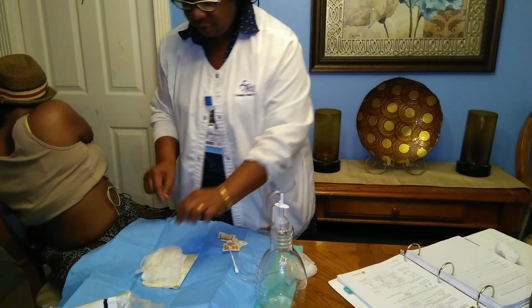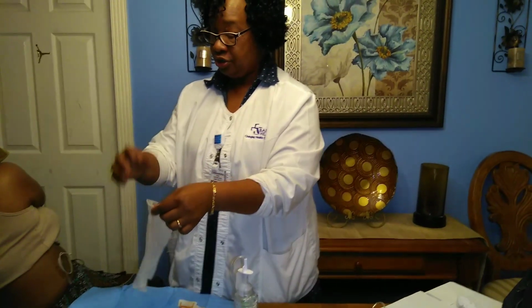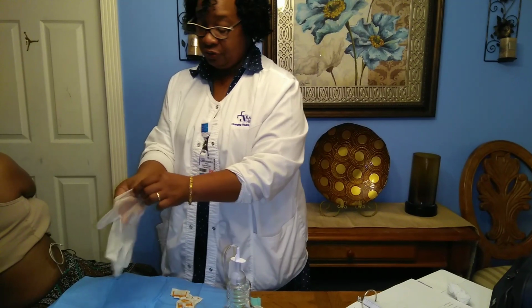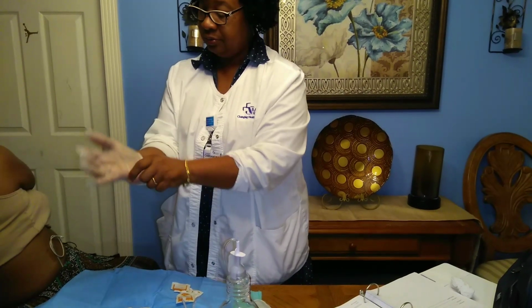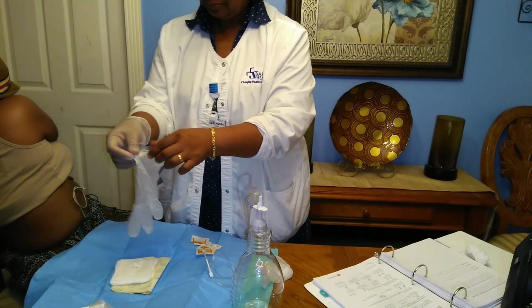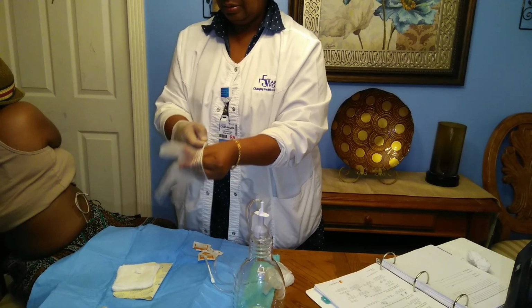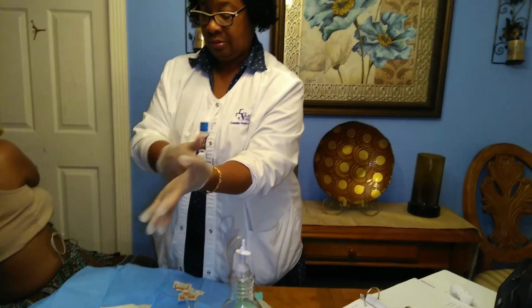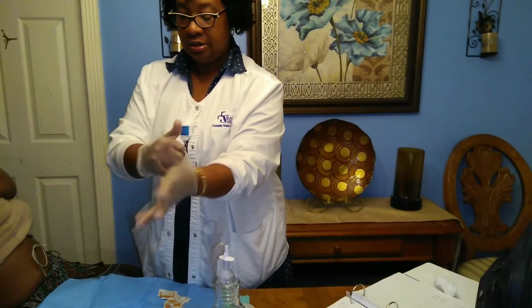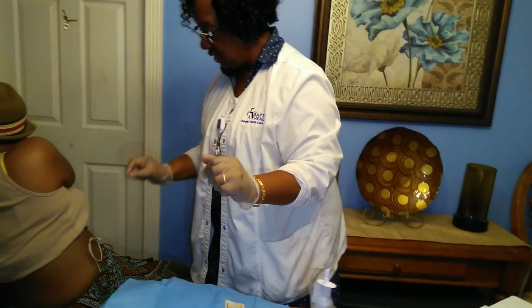Then I will go ahead and put on my sterile gloves. Making sure, again, that I wash my hands before with my hand sanitizer. I put on my sterile gloves, being careful not to touch anything. So I would take the patient's catheter.